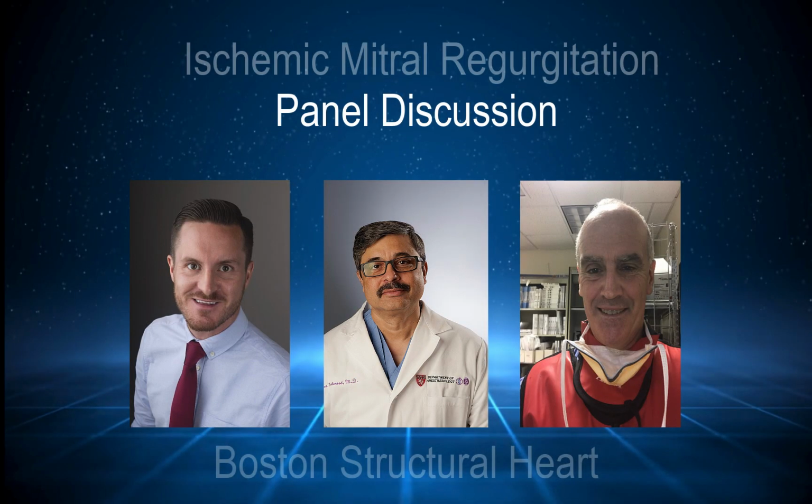So in this case, we had a patient with mitral regurgitation, not significant indices of remodeling. You went on to do repair. Despite Andy wanting to make more points about remodeling, I'll ask a more provocative question. We talk a lot about this mitral regurgitation assessment, and people argue about the PISA method and the vena contracta method and all that stuff. Don't we just, in reality, eyeball it and say it's mild, moderate, or severe? What do you think?